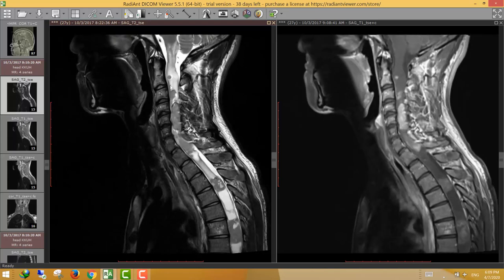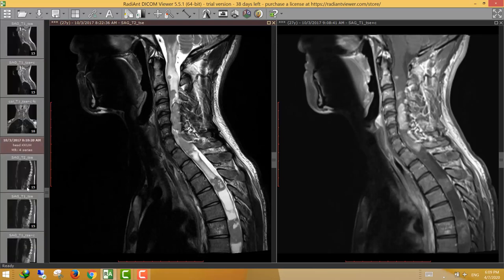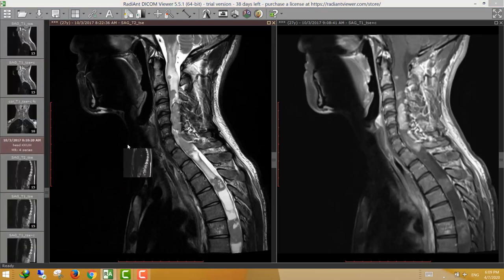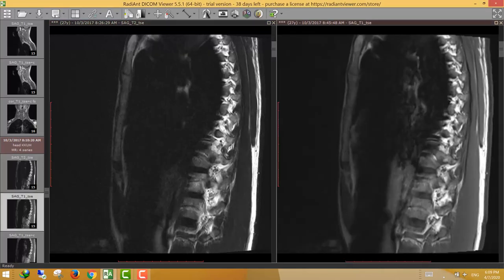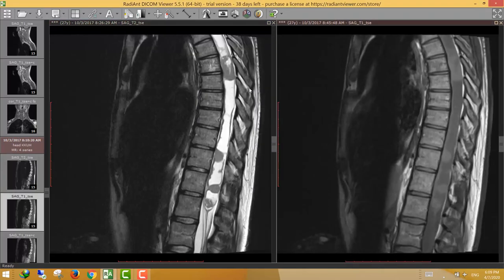So these lesions represent spinal cord ependymomas. In the dorsal spine, we also see similar lesions extending along the whole length of the spinal cord down to the conus medullaris. In such a patient, searching the spinal cord for ependymomas is the first item we look for.